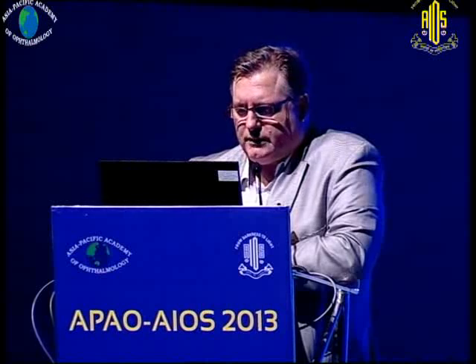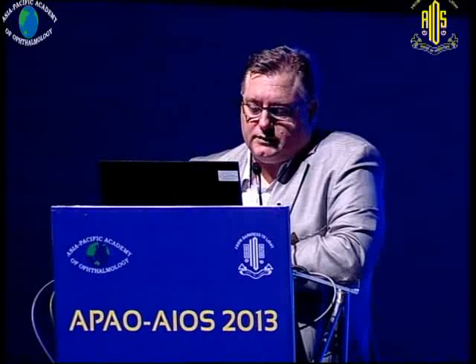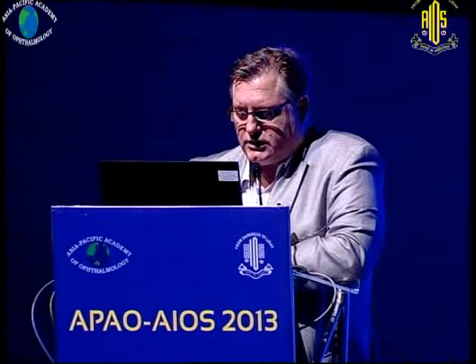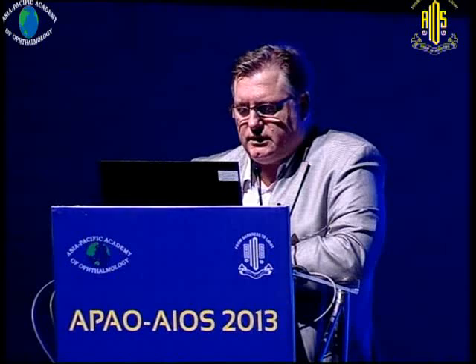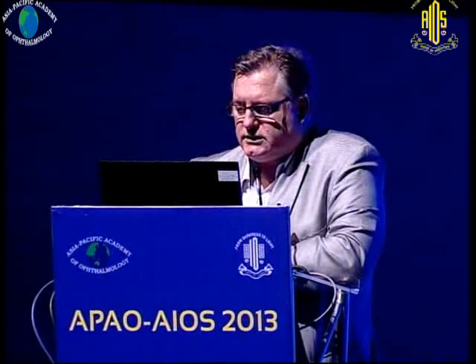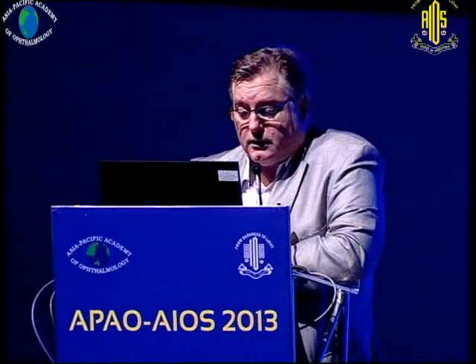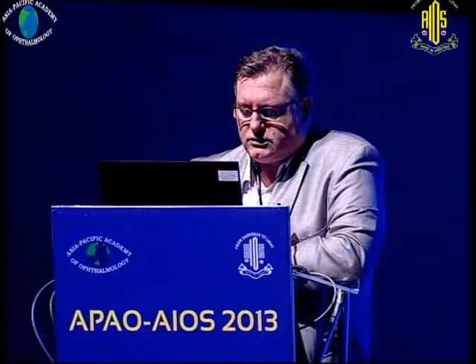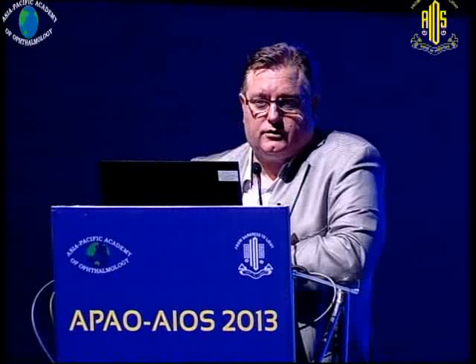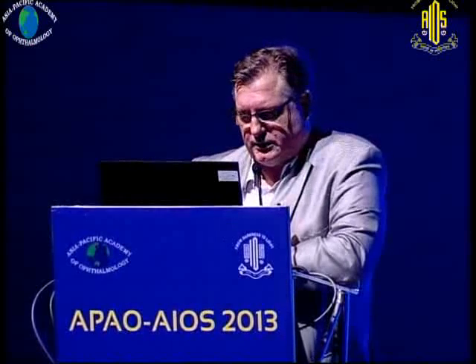The refractive correction was stable over 3 years now, 4 to 5 lines gain, but we have a small myopic shift. 80% to 90% were without reading glasses, so far no regression. It's minimally invasive. However, there are some side effects, a small decrease in contrast sensitivity, but also a loss in corrected distance visual acuity, and this was up to 12-15% with loss of 2 lines. However, as they are binocular, they were fine. We have some halo sometimes around light sources. Most of them go away, but sometimes it can also be longer. The only problem is that you don't have a real option for complete reversibility or for corrective treatment.